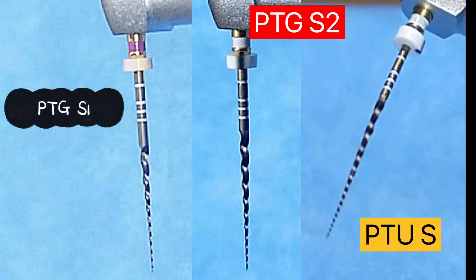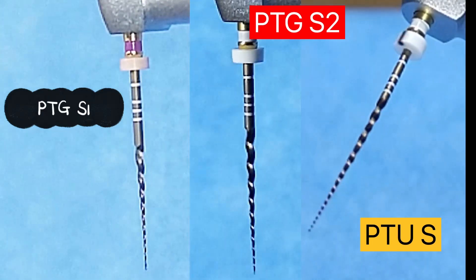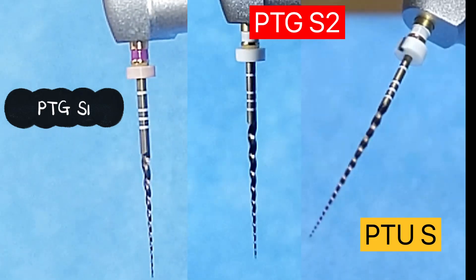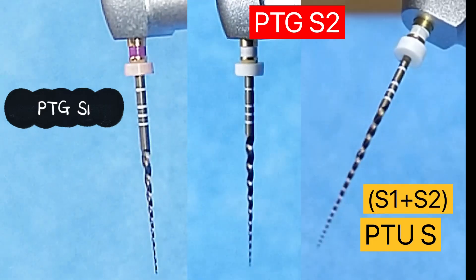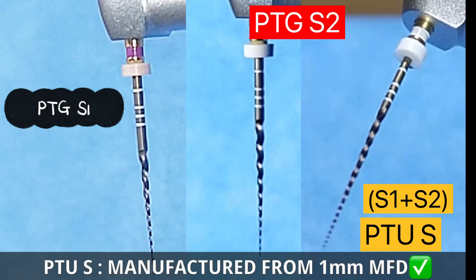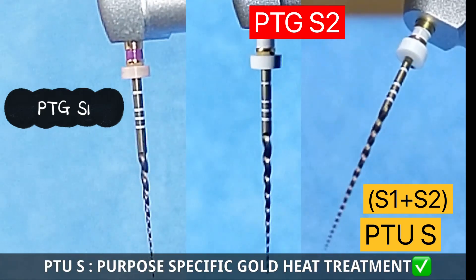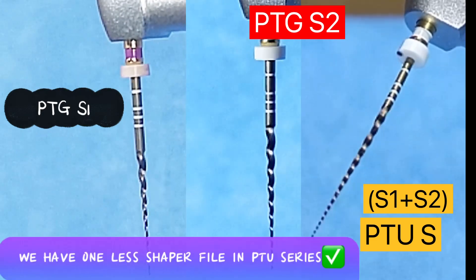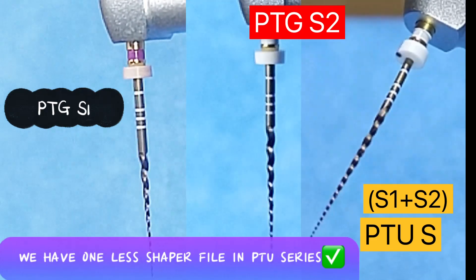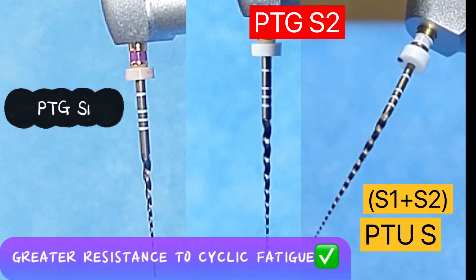Take a deep breath, chill, relax — pause the video and let me know in the comments whether you could recognize these files. The first one is S1 from Pro Taper Gold Series, the second is S2 from Pro Taper Gold Series, and the third is the Shaper from Pro Taper Ultimate Series. Key difference: the Shaper from Pro Taper Ultimate is a combination of S1 and S2 of the Gold Series. It is produced from a 1mm maximum flute diameter versus 1.2mm maximum flute diameter of Pro Taper Gold Series. This Shaper has a purpose-specific Gold Heat Treatment, and its alternating offset with variable parallelogram cross-section provides better cutting efficiency and greater resistance to cyclic fatigue.